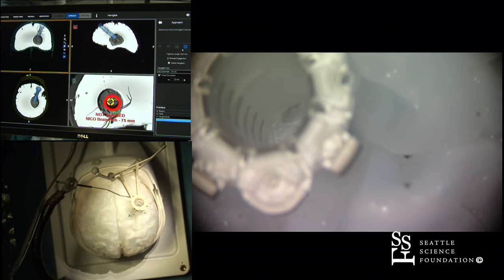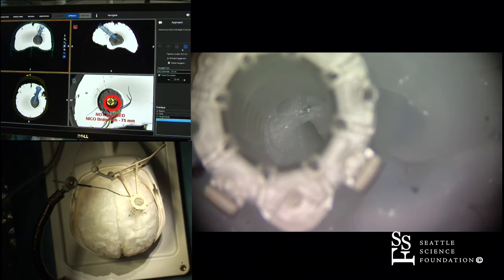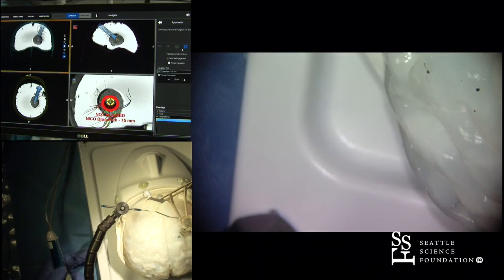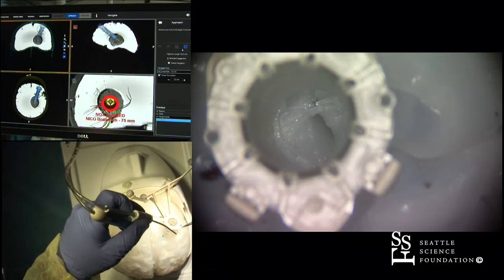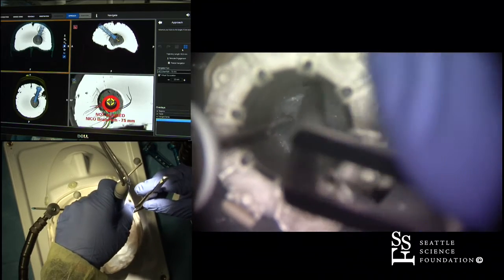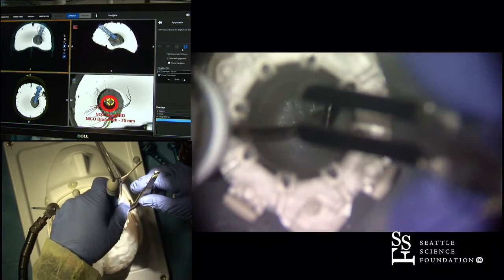One thing is that I'm not lined up like I would normally be. I would normally be sitting on the other side here, because you want to have your body kind of aimed. At any rate, down the tube — I can bipolar and suction and resect and work all at the same time to do this.